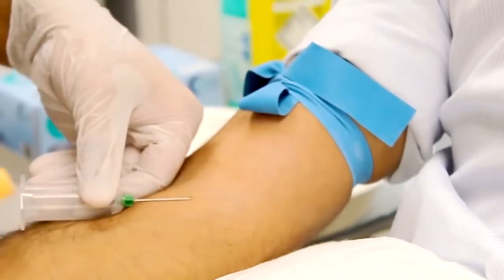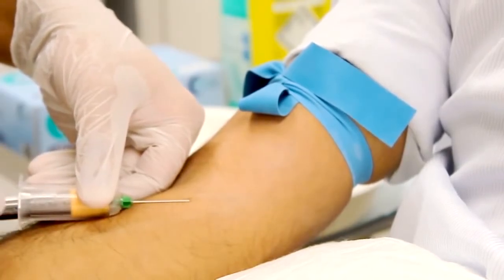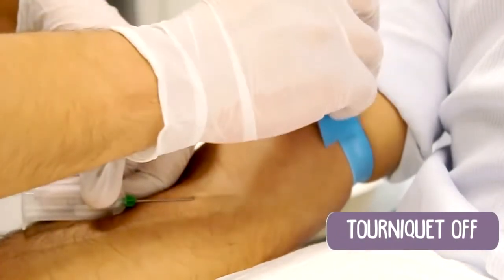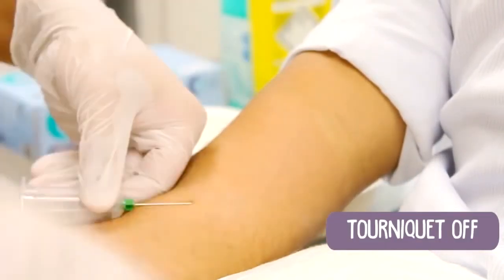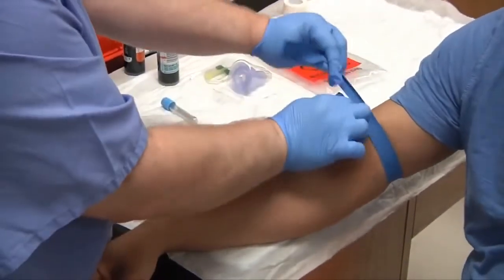Anchor the needle with your non-dominant hand and don't move. Try to keep it as stable as possible. And once you've taken your blood, before retracting the needle, it's important to take the tourniquet off. If you don't do that, it could lead to quite messy situations. So, tourniquet off.